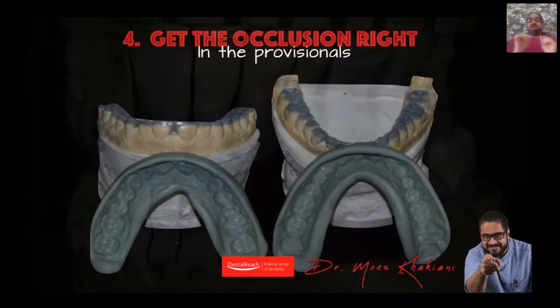The difficulty comes in at the temporization phase. This is where your clinical skills come in. So try your level best to do complete justice to the bite. What have I done here? Mounted the casts in centric relation. The technician has done an additive wax up, which means the technician is not allowed to take a burr and trim the tooth. Remember, we are reconstructing, so we only add wax where attrition has occurred, which means nature has already taken tooth material away.